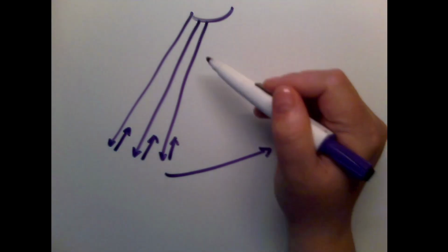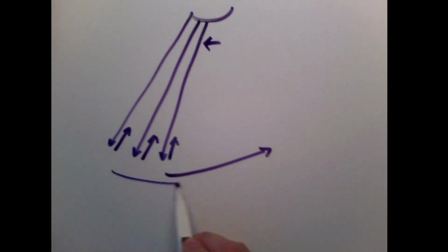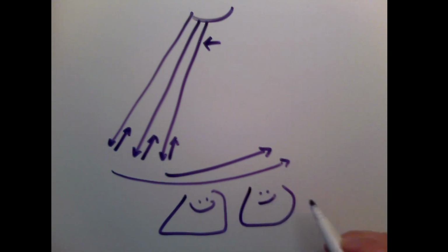The time it takes to make this pulse and then to make all the pulses all the way across the screen to get that one picture, that happens so quickly that it happens again, so our next picture might show something slightly different, and it happens again so quickly, so our next picture shows something slightly different. And it feels like it's moving right along with us. That's how fast all of this is happening.